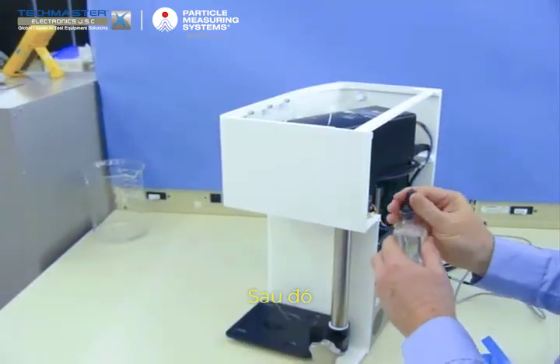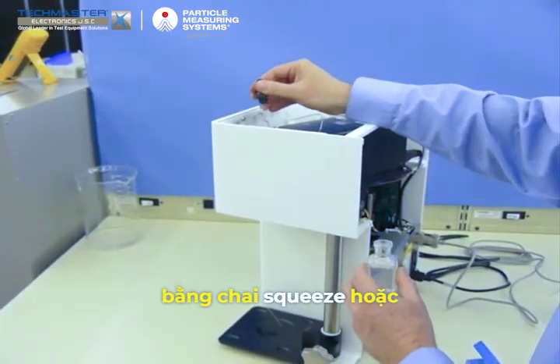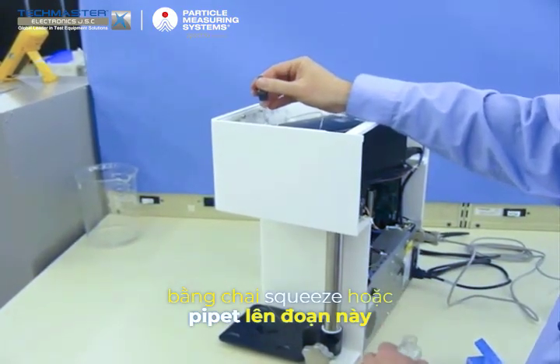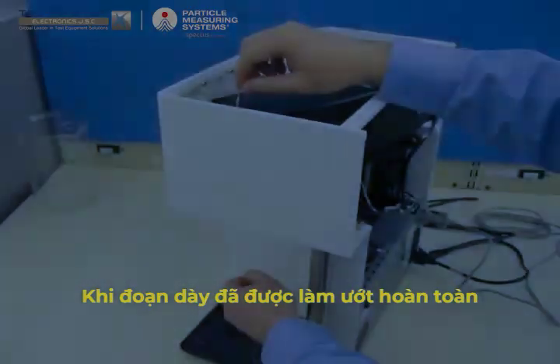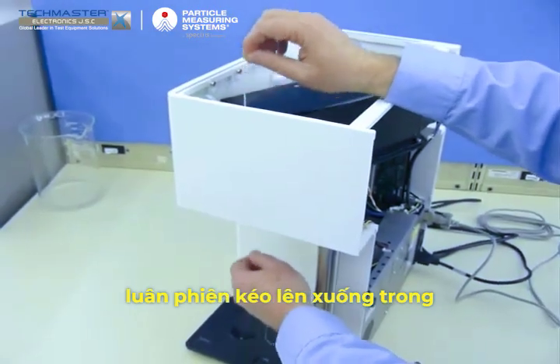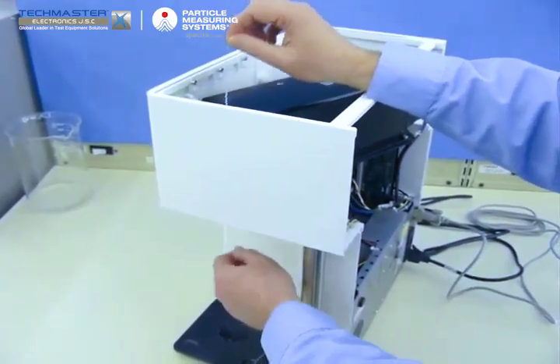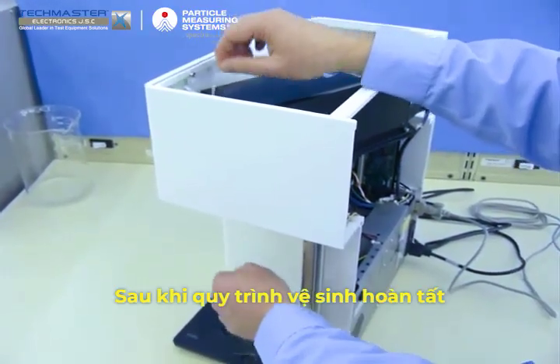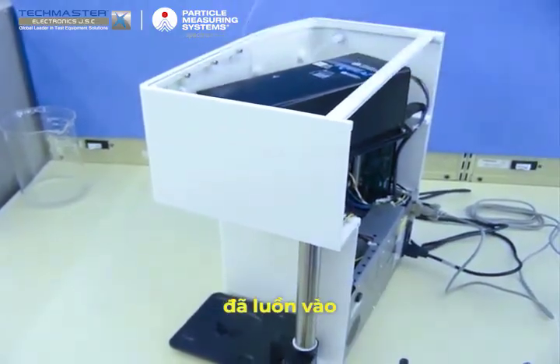It is a simple task to squeeze a small amount onto the fat section with the squeeze bottle, or use the eyedropper to do the same thing. Once you have the fat section fully wetted and pulled into the sample cell, alternate pulling it down and then up for anywhere around 30 to 60 seconds. Once you are satisfied with the cleaning effort, simply pull the floss back the way you threaded it in.